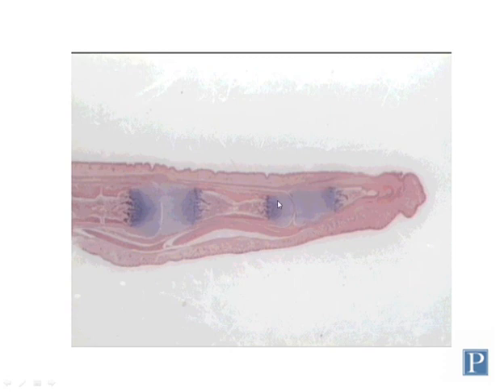The matrix of bone, again, is more eosinophilic, and so the newly laid down bone in the diaphyses of these bones is eosinophilic. So these are long bones that are actively developing, and development of long bones occurs through a different process which is called endochondral ossification. So flat bones develop by intramembranous ossification, and the bony trabeculae develop directly from mesenchymal cells.